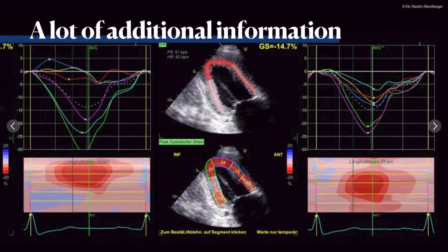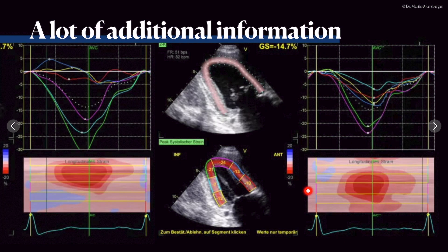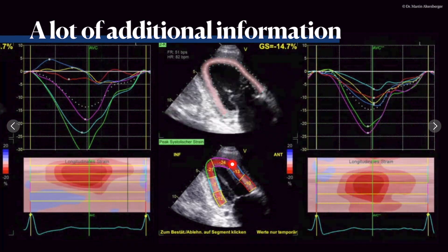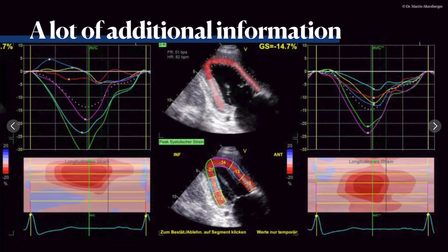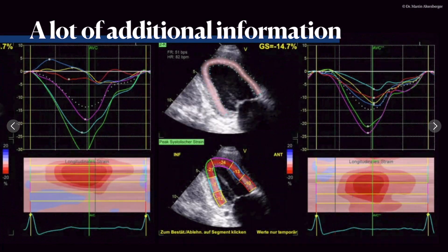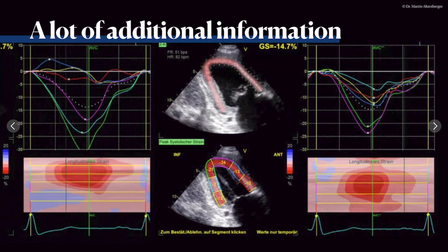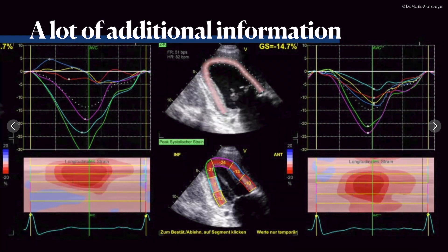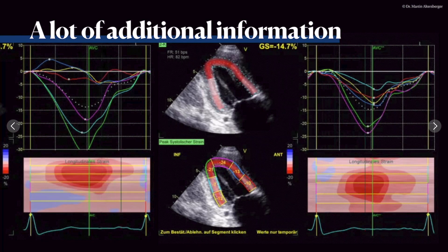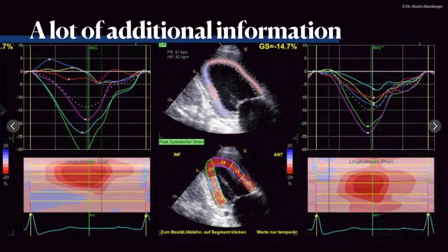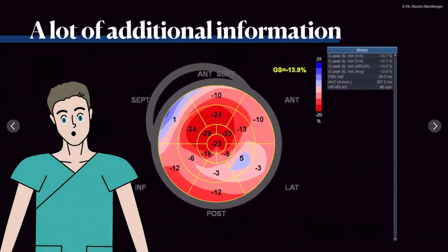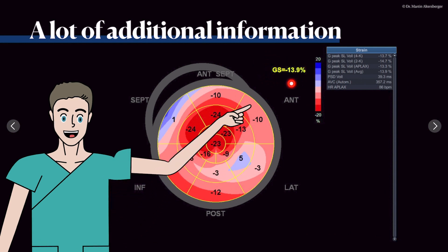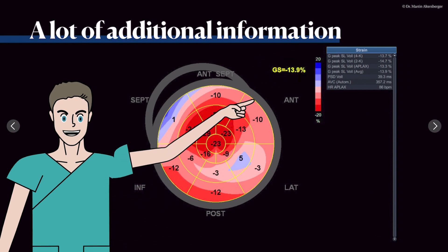In the strain M-mode, the color code in the center represents the apical regions — red here means normal contraction, so a normal negative value and normal strain. Overall this was in the range of minus 12 to minus 15 percent. Looking at the global longitudinal strain on the bullseye plot, the global strain was minus 13.9 percent.